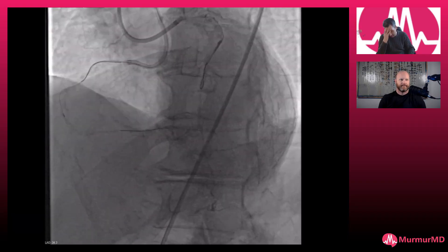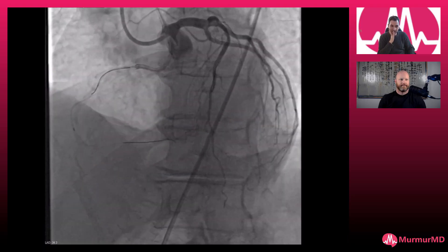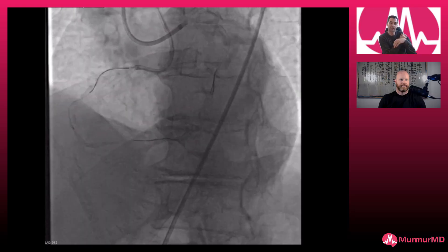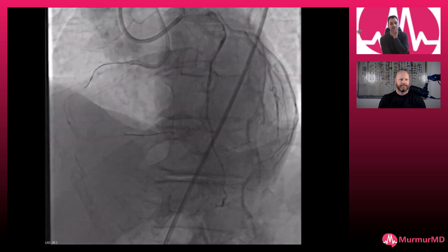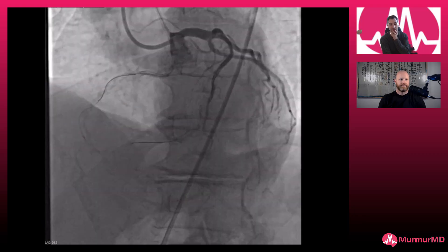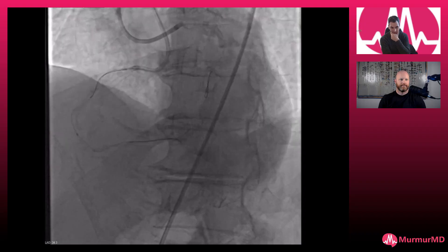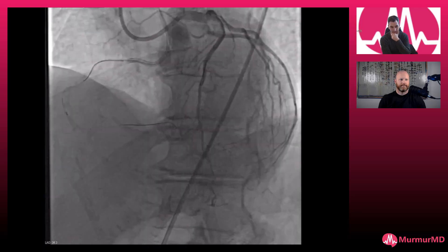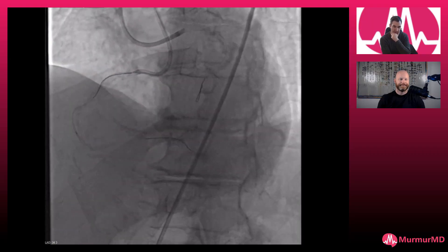You haven't done dedicated ADR, so I don't think it's going to be a long subintimal portion. I would see if you're able to get the microcatheter down, then make a quick-fire decision depending on how hard it is. If it's difficult, I'm going to immediately drop an atherectomy wire because I've been burned before trying to do pragmatic pre-dilation, and then later in the case when I want to go back to atherectomy, it's a nightmare to get the microcatheter back down. If the microcatheter flies down, I might put a wiggle wire and try to pre-dilate. But it's going to take a lot of work before you can get lithotripsy in with this degree of tortuosity — so maybe pre-dilatation, get the guide extension down, then lithotripsy versus atherectomy and then lithotripsy after.